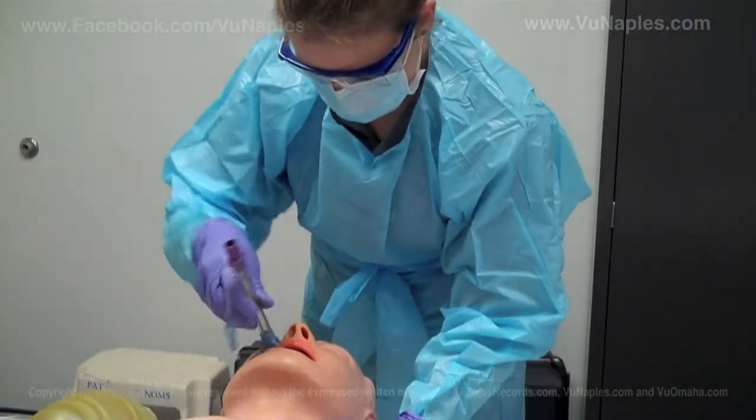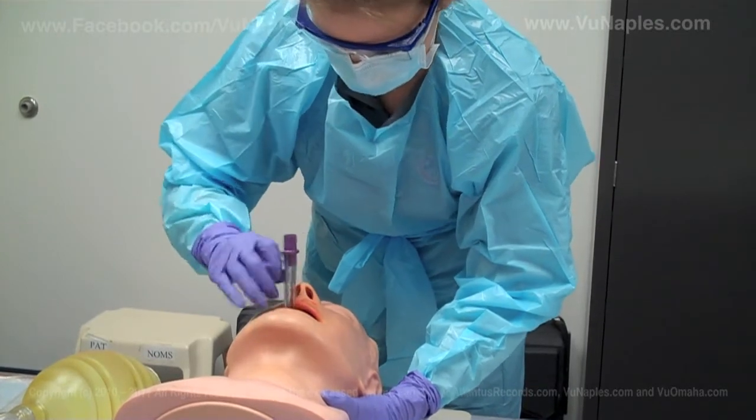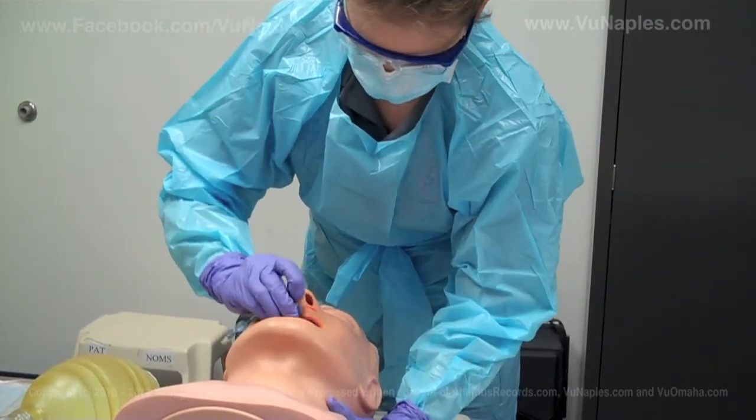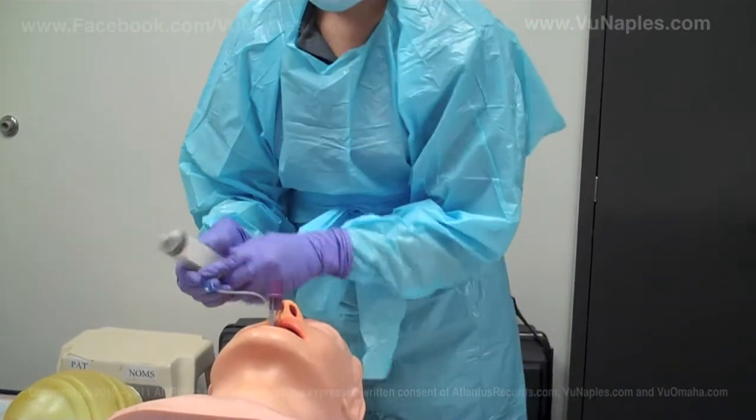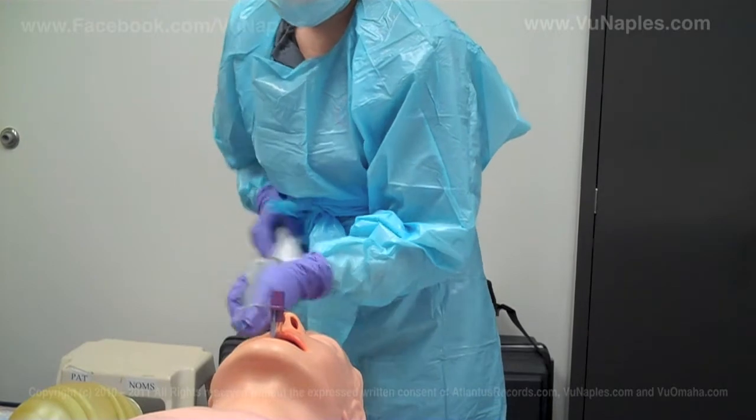Here, I'm just going to push this down into the airway, and this goes into the esophagus. Push that in, and I inflate my tube.